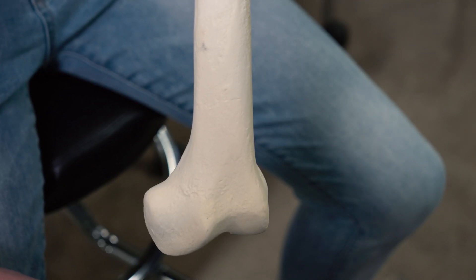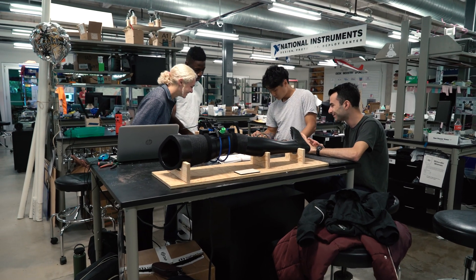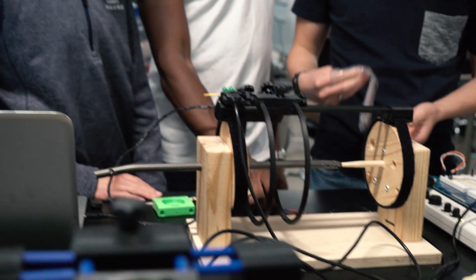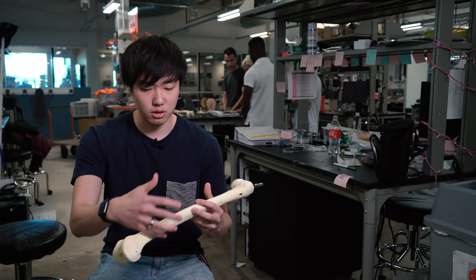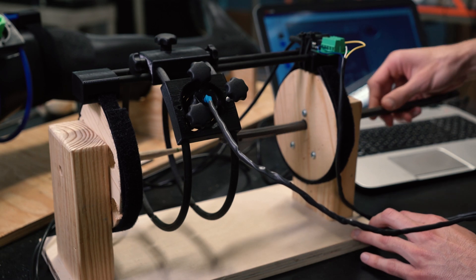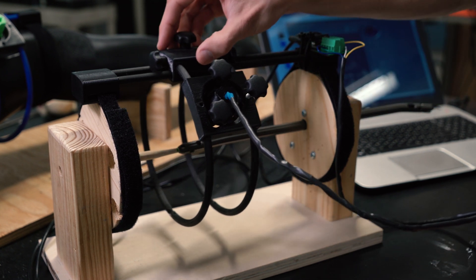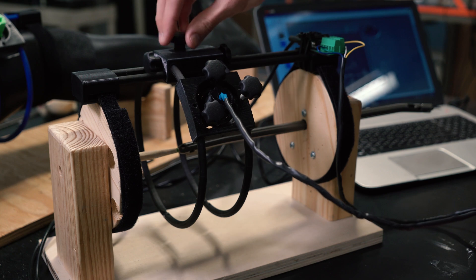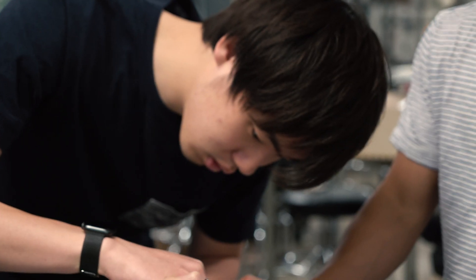We're Drill Team 6, and we made a device that instead of using x-rays uses a magnetic sensing system. We put a magnet at the distal hole location — at the holes at the end — and then we have a brace with a magnetic sensor that streamlines this process to find the magnet in a way that doesn't use x-rays and is very simple and consistent.